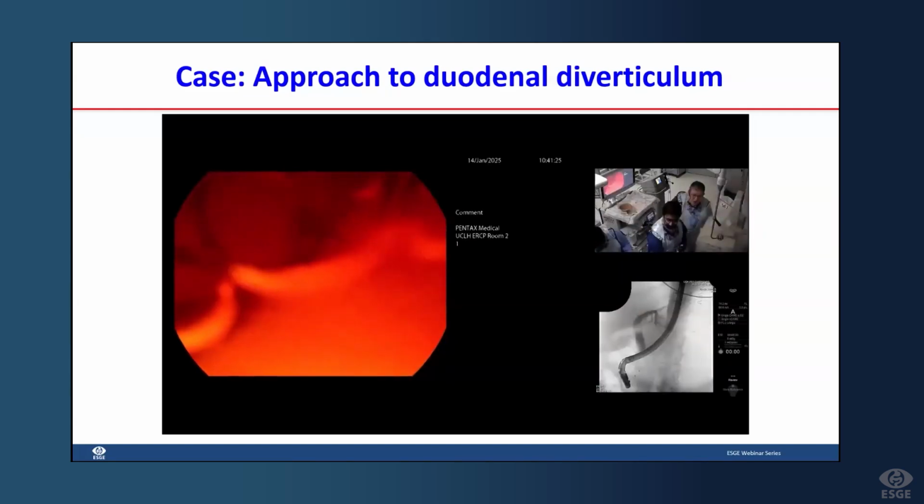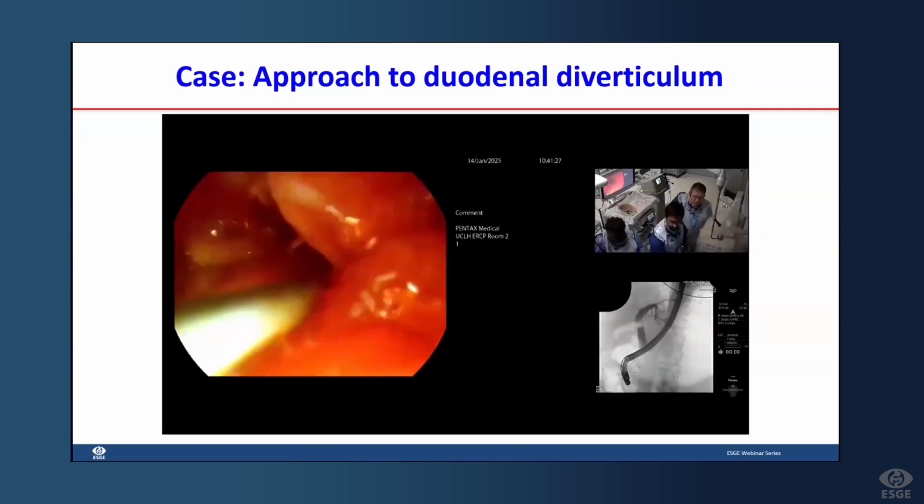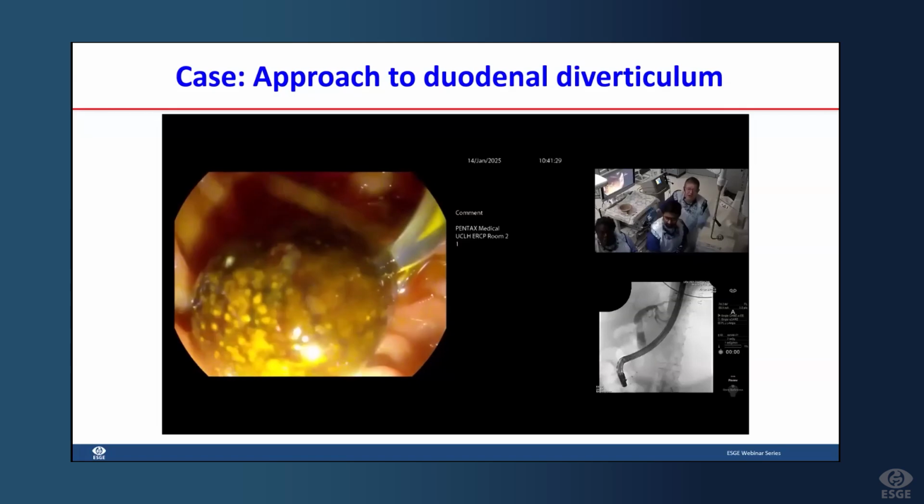And then gentle clockwise torque and push in, keep screening. It's beautiful. Oh, look at that.